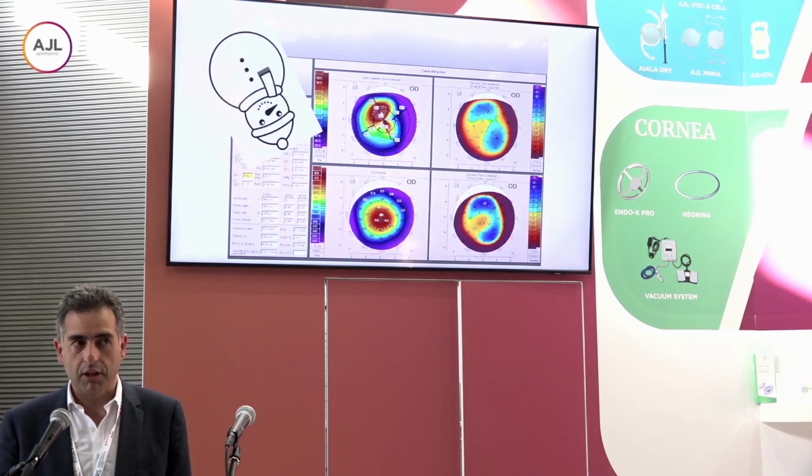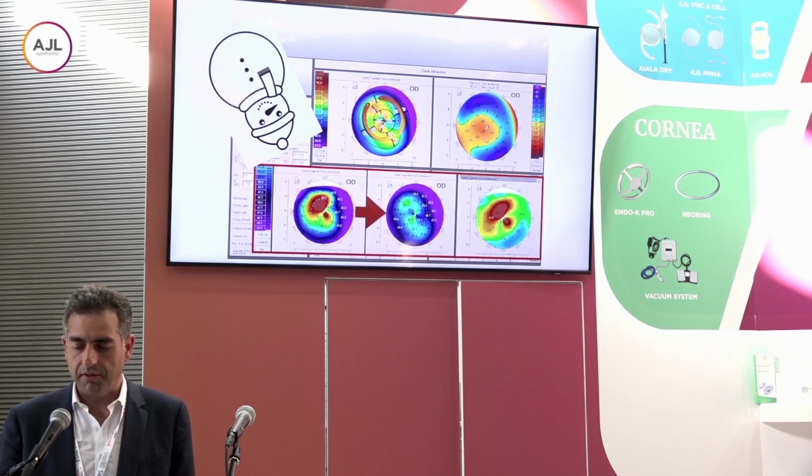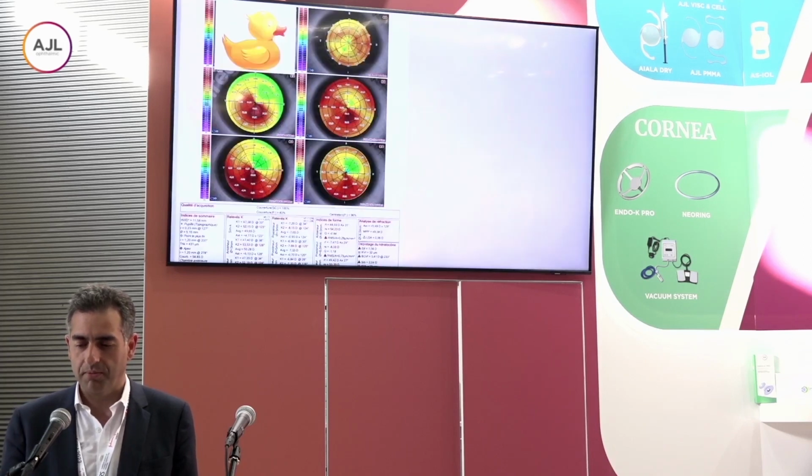This is an inverted snowman, which needs 2 rings. The result is very good, and look at the differential map, which is exactly the effect we have to reach.